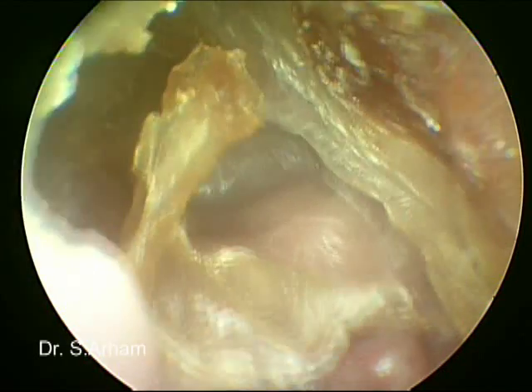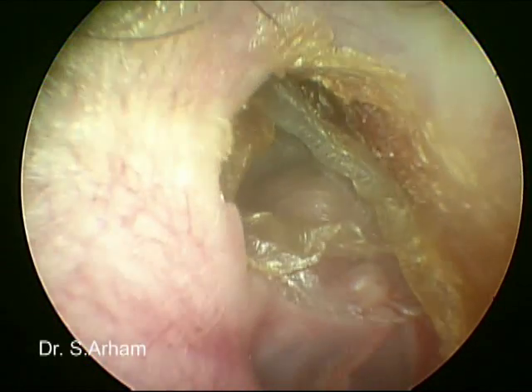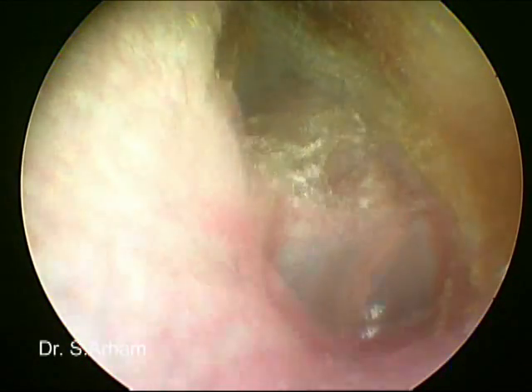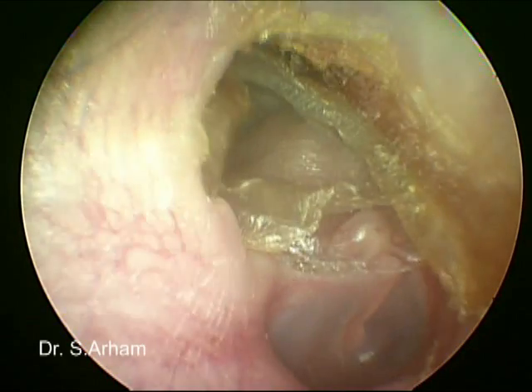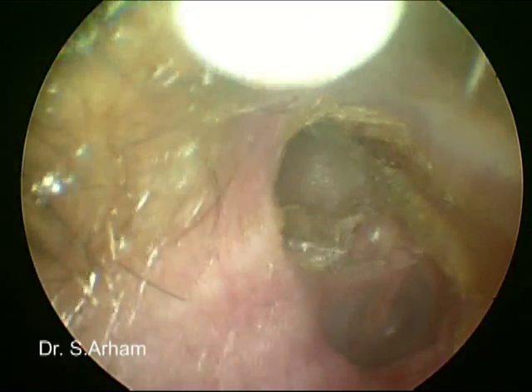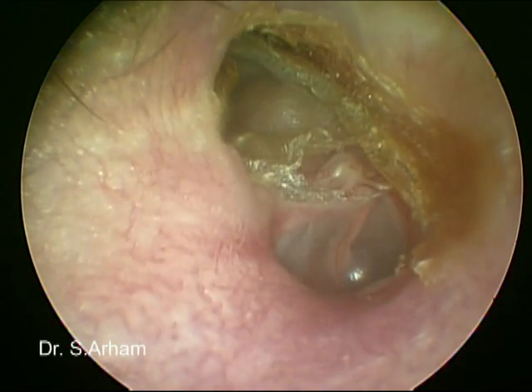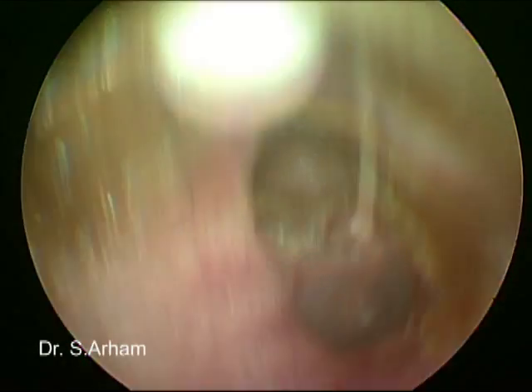It is nearly after one year of the surgery. Now during the follow-up, we have to remove this wax and the debris if it is there in the mastoid cavity, and this can be done easily using endoscopes.